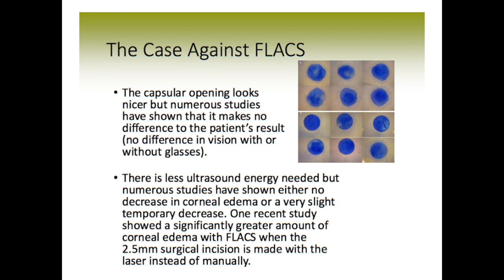So you see in the upper right section here, these are the capsular buttons that were removed after it was torn manually by the surgeon to make the opening in the front part of the capsule, and you can see they're somewhat irregular. And down below you can see that they're perfectly round. These, of course, have been dyed blue for easier visibility. But the interesting thing is, study after study has not shown any evidence that the vision is any better with or without glasses.